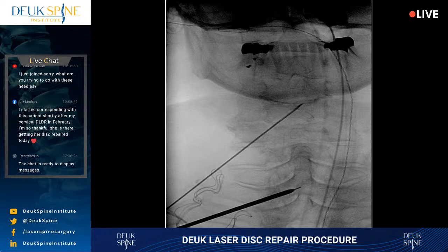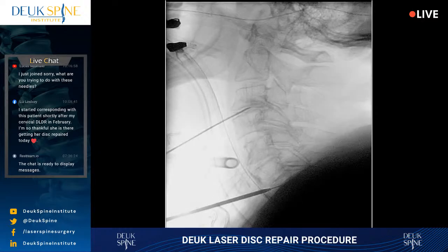All right, good. We're in the middle, just slightly to the patient's right side of midline. What I'm aiming for, there are 2 muscles that run on the front of the spine up and down called the longus colli muscles, and I want to avoid them. I want to be between them, and there's probably about 5 millimeters or half a centimeter of space between them. You're fine. All right, can we make that better? I think you've got to wag a little bit so we can see down the disc.